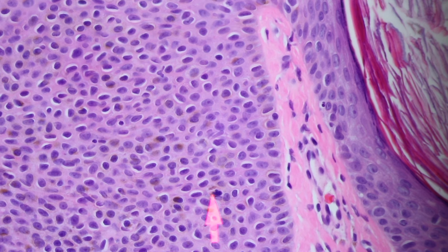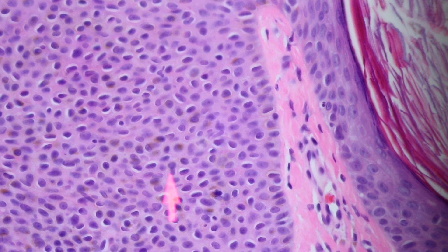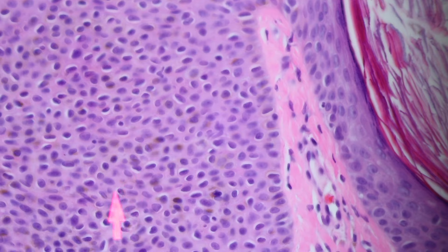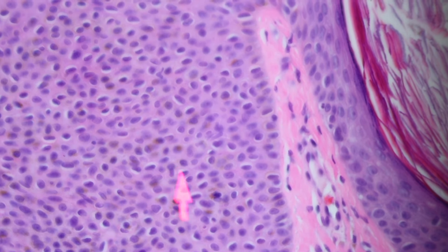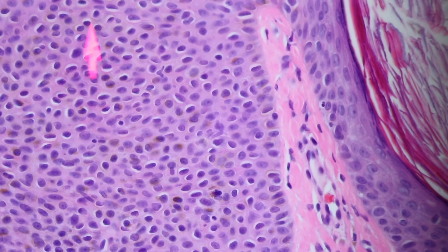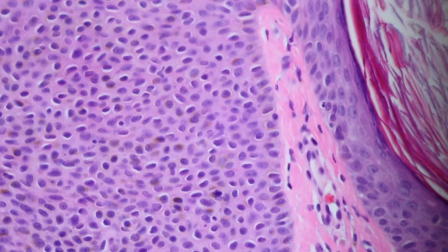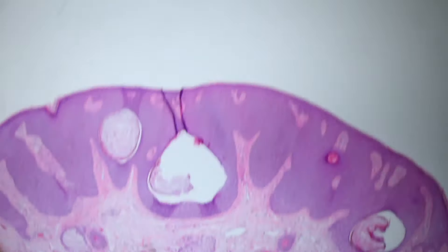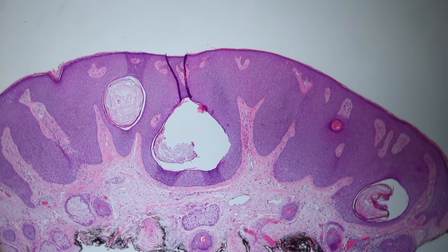They're actually keratinocytes. If you see a little halo with a naked nucleus in the middle, that's a good sign you're probably dealing with a keratinocyte, not a melanocyte. So this is a seborrheic keratosis, and these are benign.